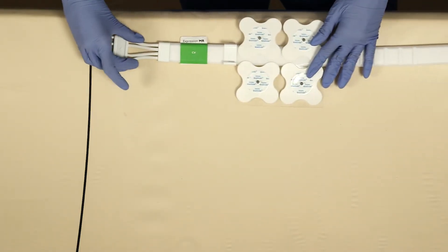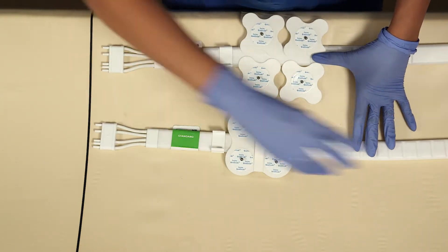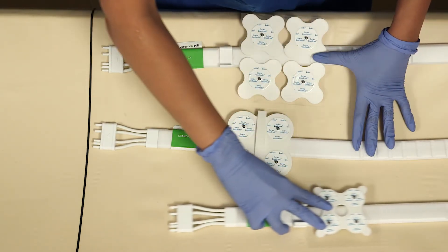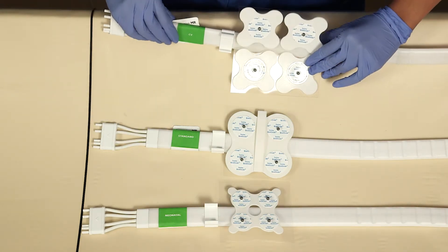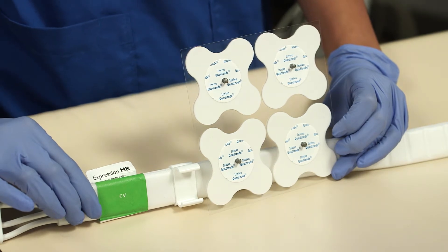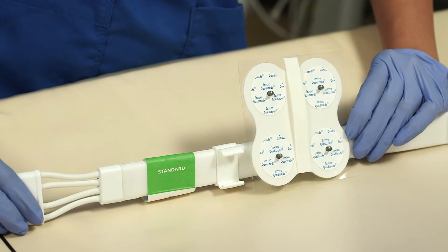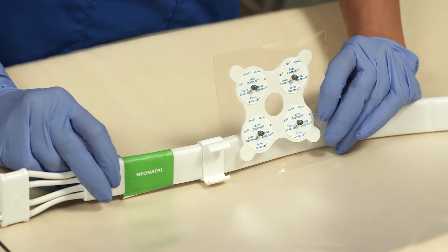Before placing ECG leads on the patient, you want to make sure you pick the correct electrode with the correct ECG cable. There are three types of ECG cables that pair with the three different electrodes. The CV ECG cable is made for the CV quatrodes, which are the quatrodes that are separate. The standard cable is made for the single patch quatrodes, and the neonatal cable is made for the neonatal quatrodes.